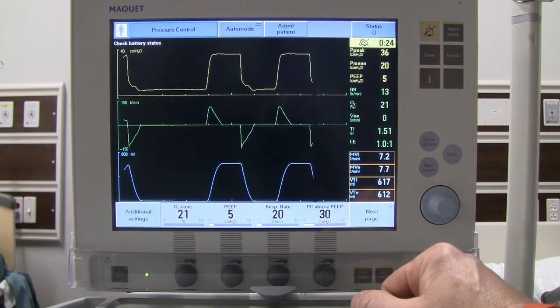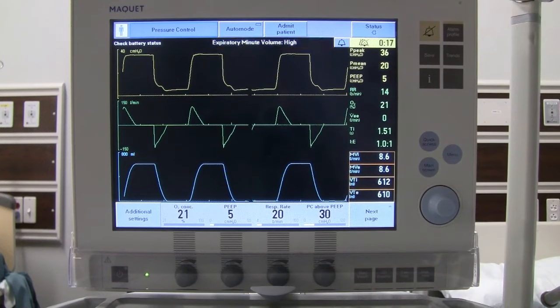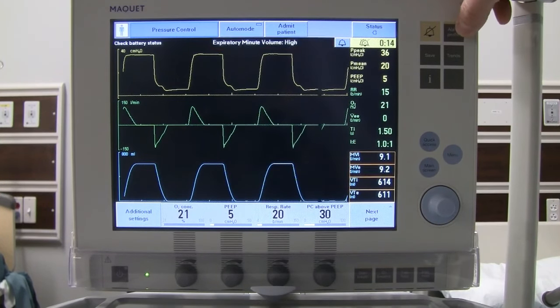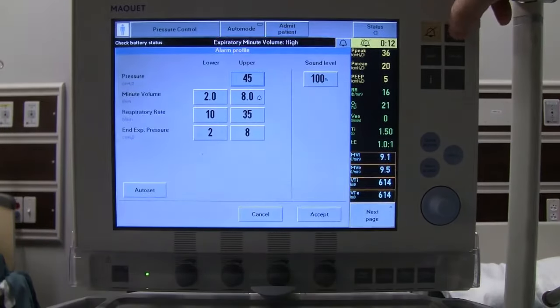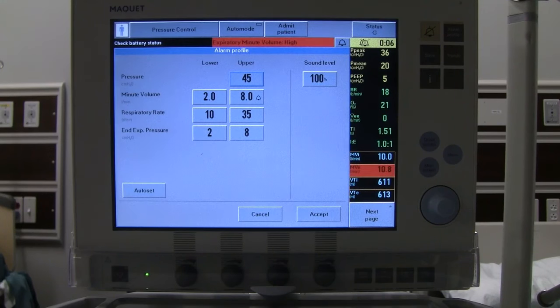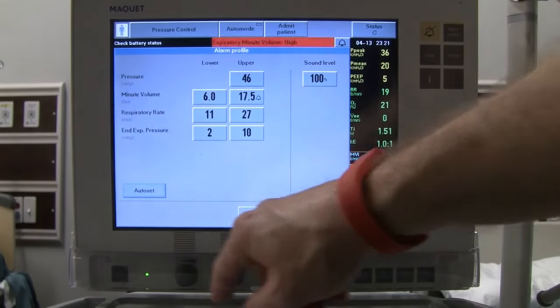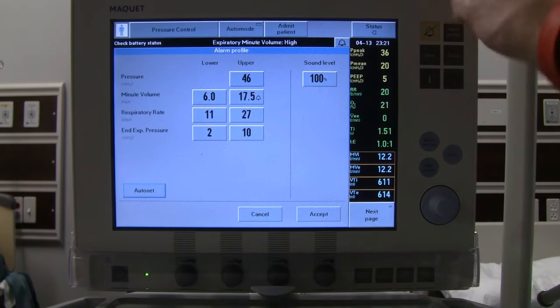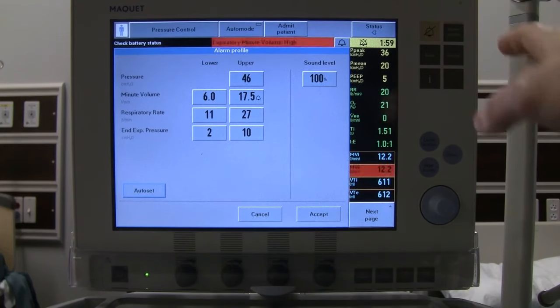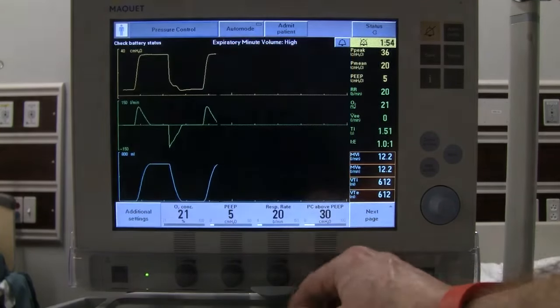Alarms will start going off after mode changes. On this ventilator, if you're actively making adjustments and monitoring your patient, you can hit auto-set to adjust alarms based on current readings. However, never walk away without adjusting the alarms back to appropriate values. Accept the alarm settings to clear the alarms.